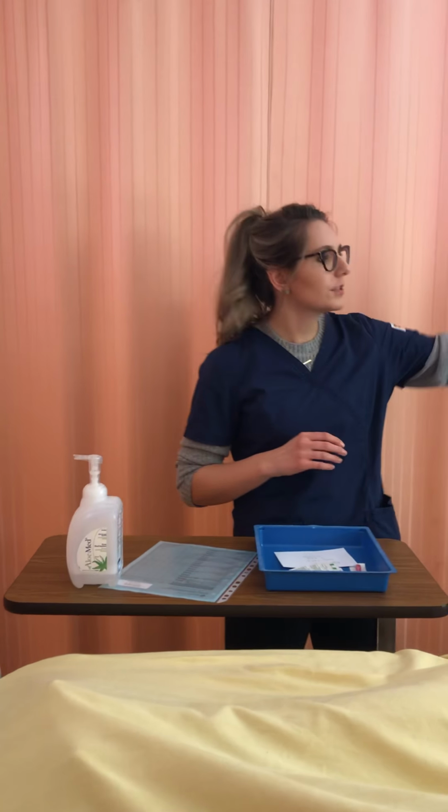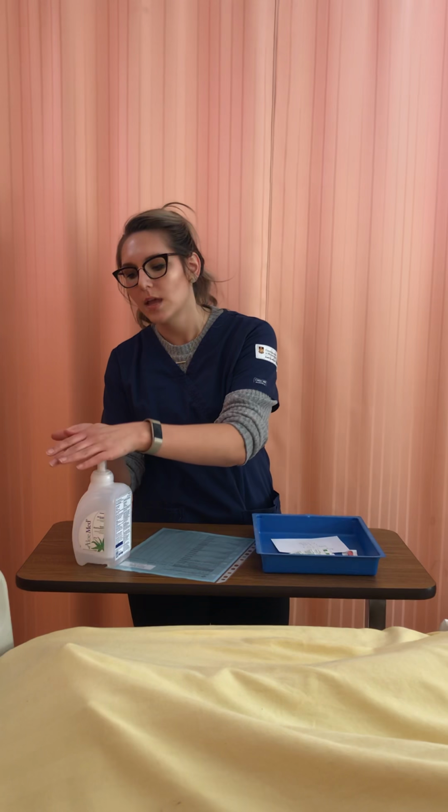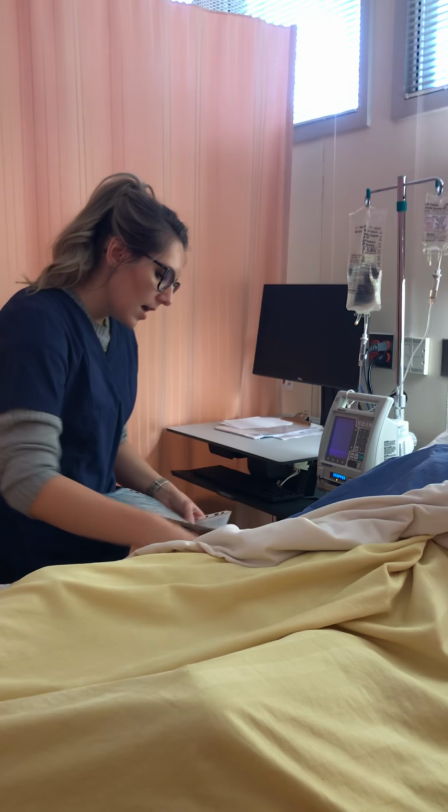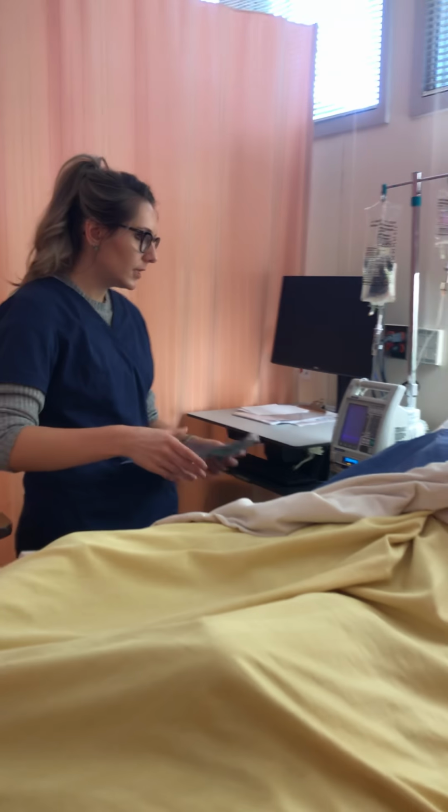Okay, hi, I'm Shanae. I'm going to be demonstrating how to do an insulin continuous infusion through Guardian, as well as doing a chest tube dressing, as well as my safety checks. So I'm just going to go in the room performing my hand hygiene. I'm going to do my 2 patient identifiers and make sure my patient's in a comfortable position and that they're doing well.